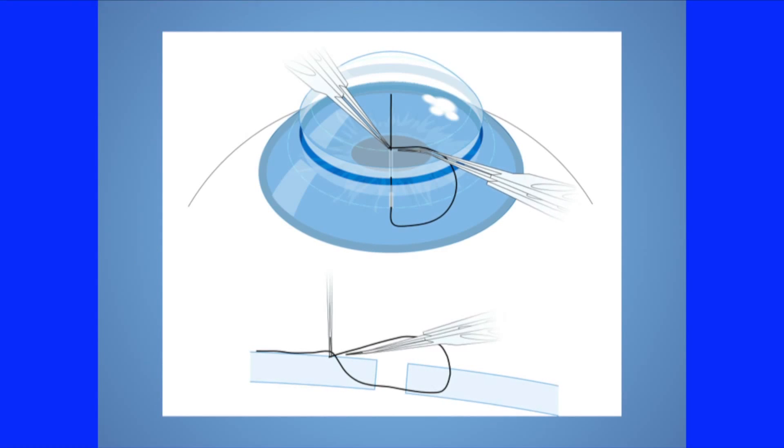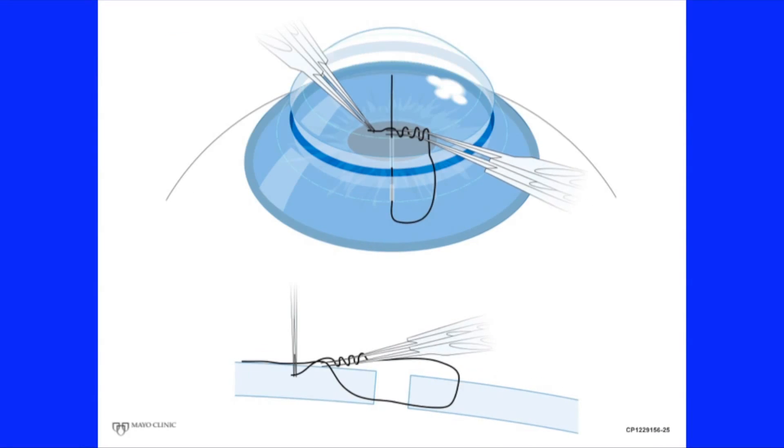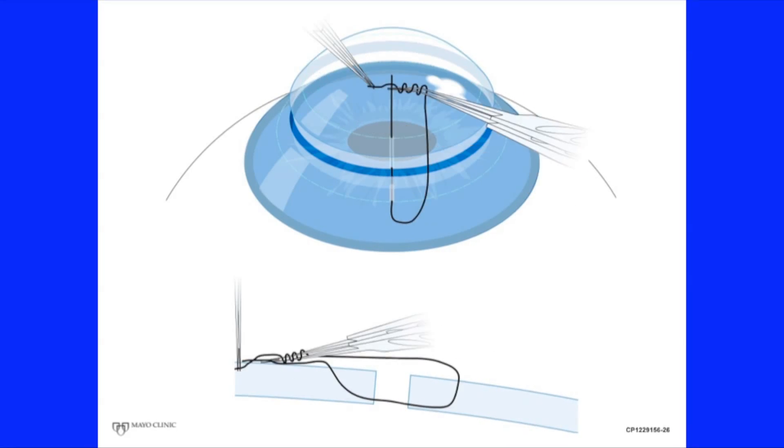To start to tie, move the straight tying forceps to the short suture but keep the curved tire in position. Place three loops around the curved tire. Gently separate the tire tips and press the side of the inferior tip into the graft surface until the short suture slides over the lower tip. Then slide the curved forceps up the short suture until you reach the tip of the suture and grab there.